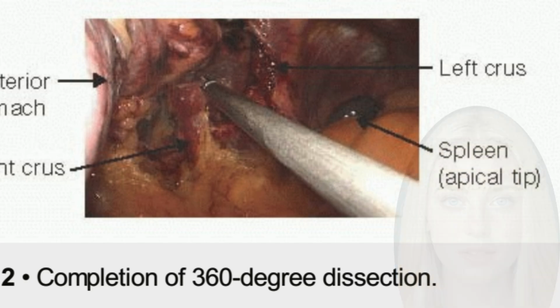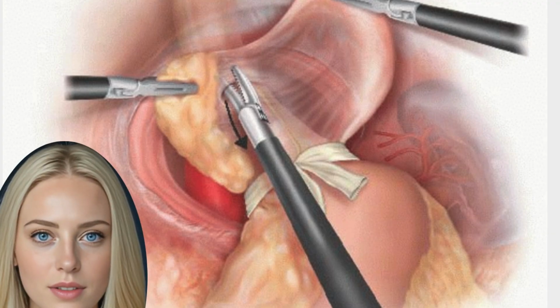Anterior dissection occurs in a 180-degree fashion anteriorly and then to the left of the hiatus, just in a plane immediately deep to the peritoneum of the hernia sac. Any deeper and thermal injury or perforation might happen to the esophagus.